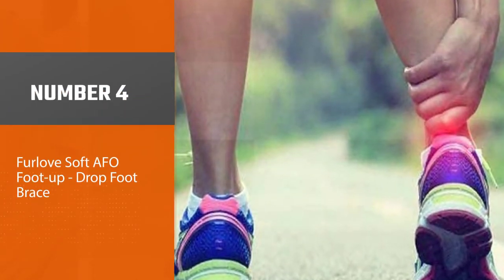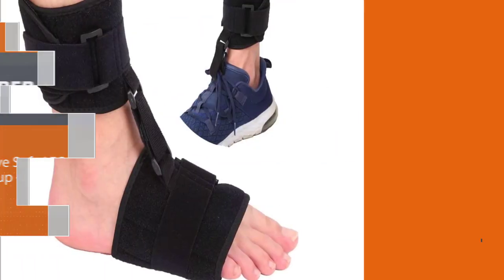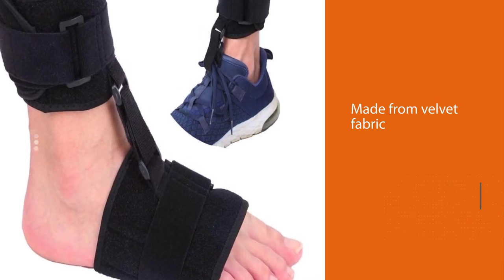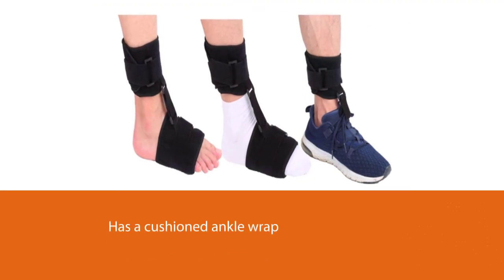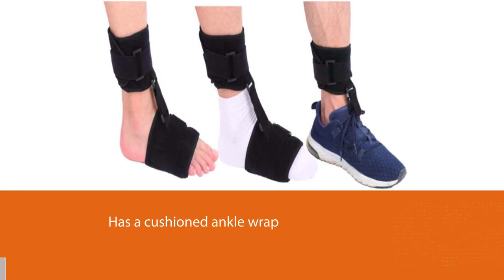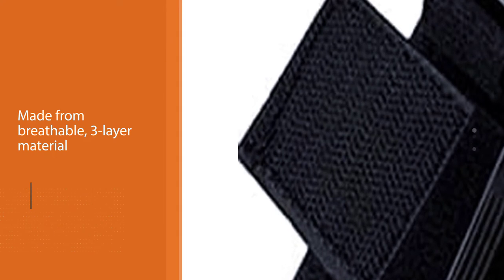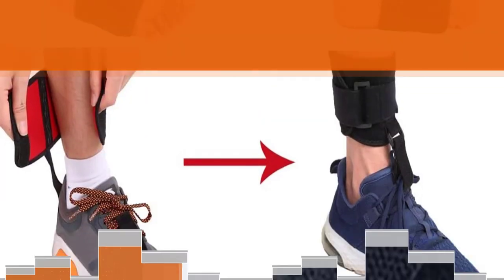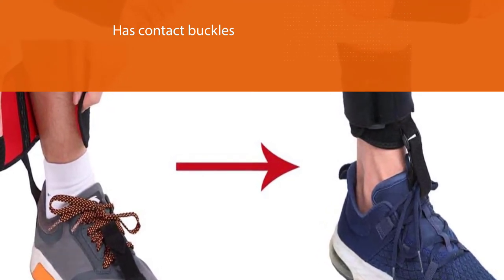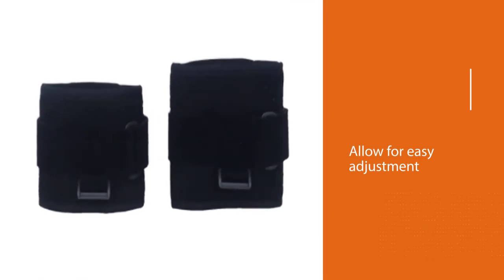Number four: Furlove soft AFO foot up drop foot brace. The Furlove AFO brace is made from velvet fabric, sponge, plastic sheet, and nylon tape. It has a cushioned ankle wrap made from breathable three-layer material for long-period wear. The sole and ankle parts can be connected at night to correct use and prevent rebound. It features contact buckles and magic paste closures for easy adjustment. It is suitable for people with stroke, foot drop, plantar fasciitis, achilles tendonitis, muscular dystrophy, and neuromuscular weakness.